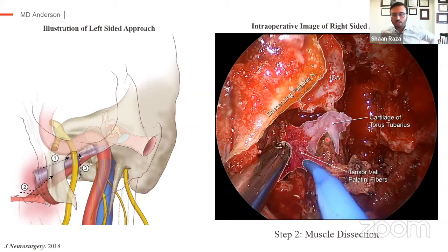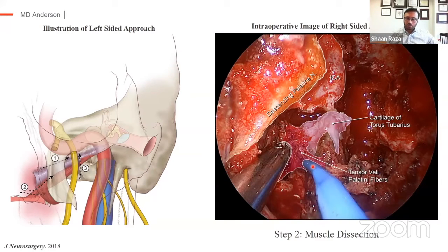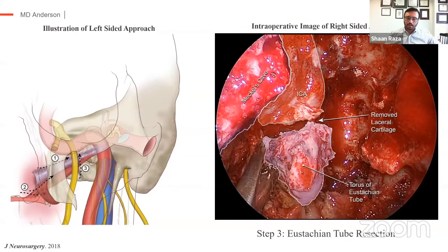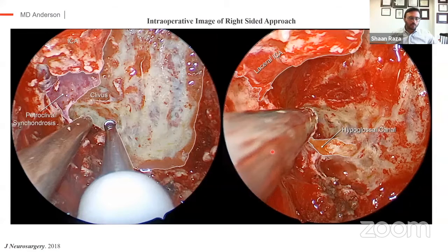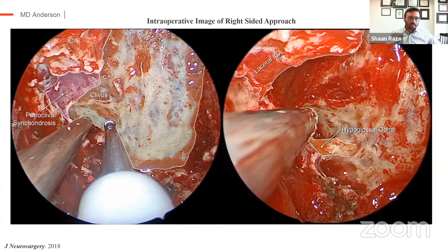The next steps are focused on dissecting out the cartilaginous portion of the eustachian tube. The muscular attachments are then dissected so that you can skeletonize the cartilaginous portion. The cartilaginous portion is then sharply transected at its junction with the bony eustachian tube — being cognizant of where the parapharyngeal carotid artery is relative to this cut. Once that's done, your access to not only the bony skull base but any tumor extension ventrally into the parapharyngeal space is readily accessible and all this bone can be drilled out. On the right image, you can see the hypoglossal canal skeletonized, the sucker tip on the medial aspect of the jugular foramen.